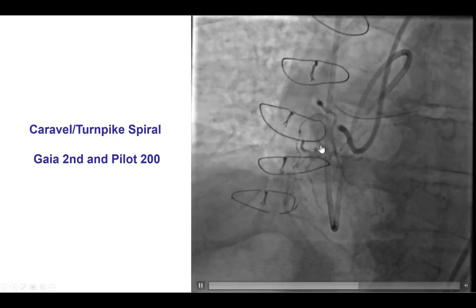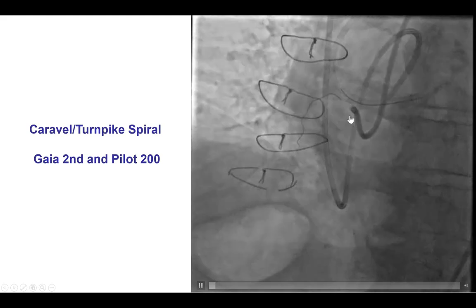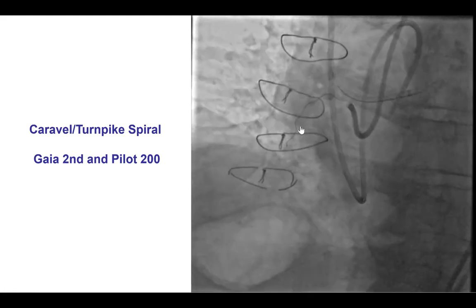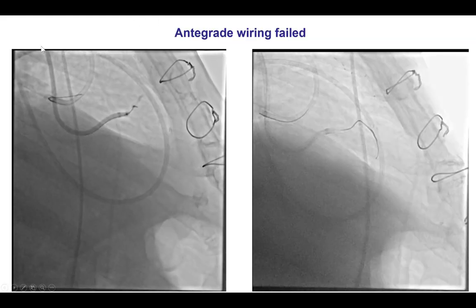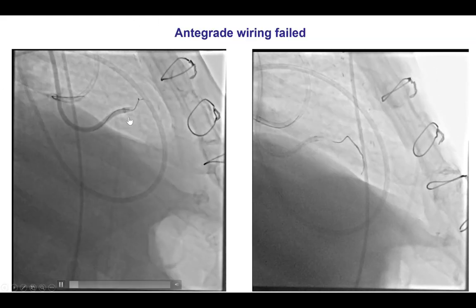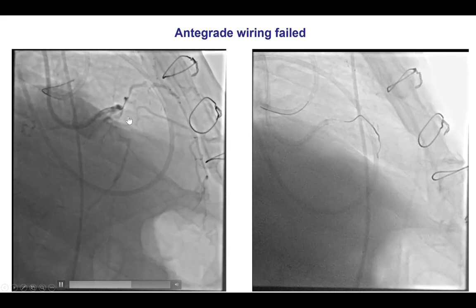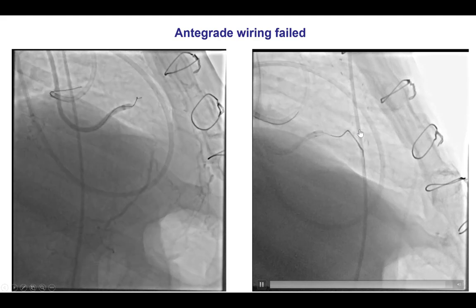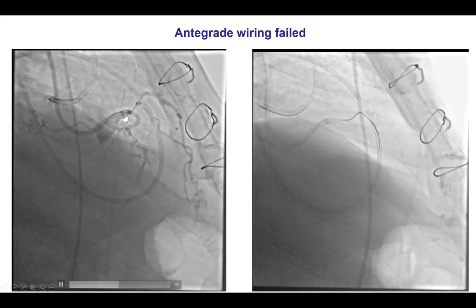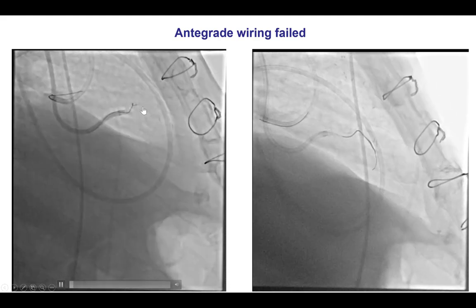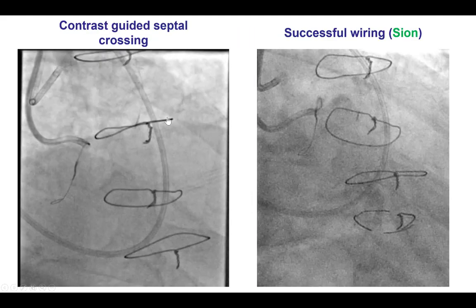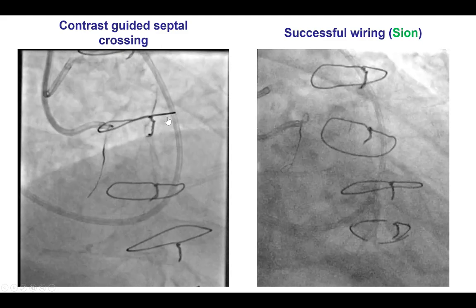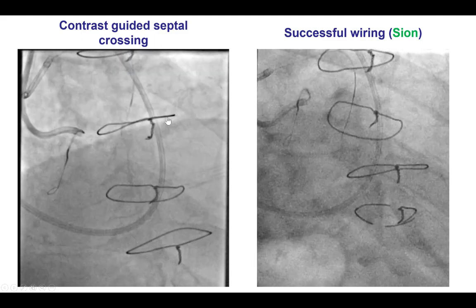In this particular case, we did multiple injections in different projections using a Caravel and Turnpike Spiral microcatheter and various guidewires. The lateral view can sometimes be extremely useful for right coronary artery lesions. However, in this case it did not really open up the proximal cap — it was still confusing whether the vessel was entering this branch or a different location. So given the difficulties with antegrade crossing, we decided to attempt the retrograde approach.